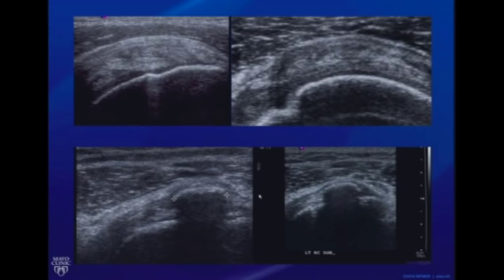When you think of tendinosis, the appearance of the tendon is very heterogeneous. As in this image, you can see we've lost that normal hyperechoic fibrillar pattern of the tendon. There is no tear, but the tendon itself is somewhat heterogeneous. And just to the eye, it seems somewhat thicker too. There are not many good numbers to go for, but I generally think if a tendon is more than 5 millimeters in thickness, then it probably is a thickened tendon. You can alternatively just compare this tendon with the opposite side and see if there is a difference between the two sides. And a difference of more than 2 millimeters between the two tendon thicknesses can be significant.